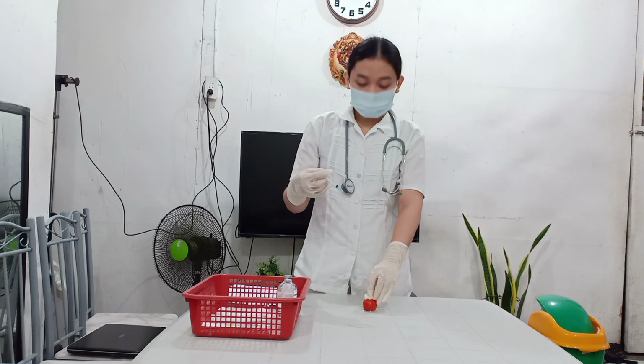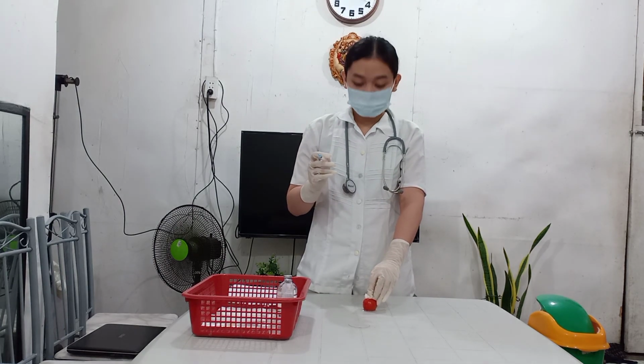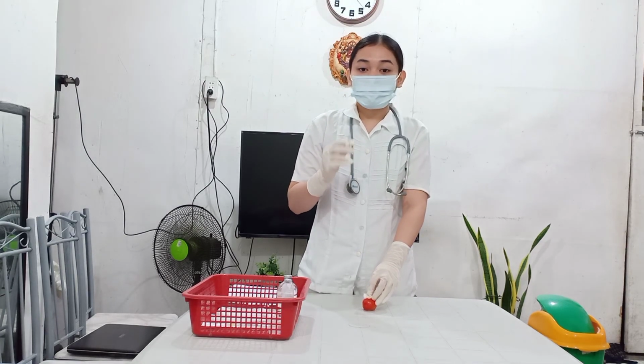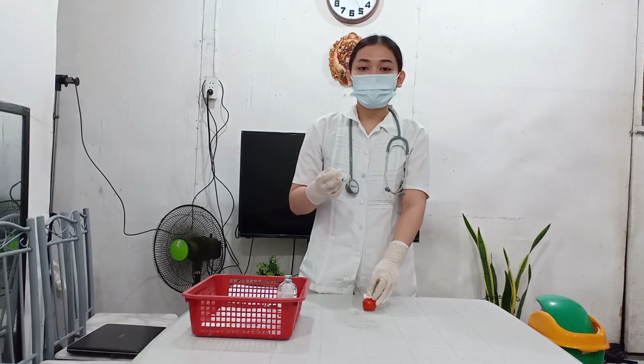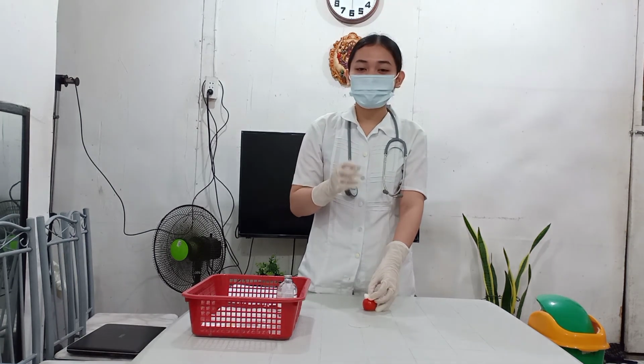And then, we quickly withdraw the needle while applying pressure with a dry sponge, because slow needle withdrawal may be uncomfortable for the client. So, we have to do it quickly.